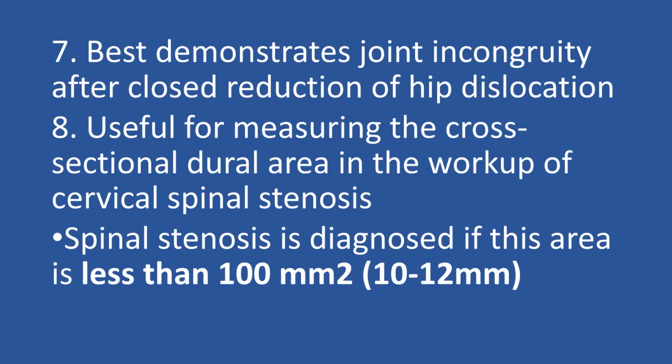It's useful for measuring the cross-sectional dural area in the workup of cervical spinal stenosis. When you have patients coming to you with cervical myelopathy, with a canal width of less than 10 millimeters, who tend to fall when they're walking, you want to confirm your diagnosis, and a CT scan will help you most. You can tell the exact measurement of the cervical spine.